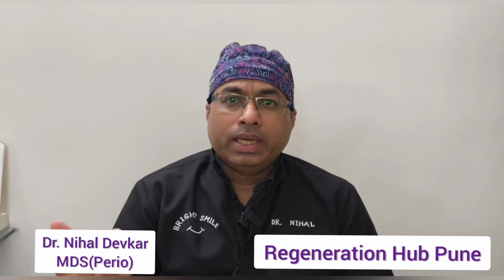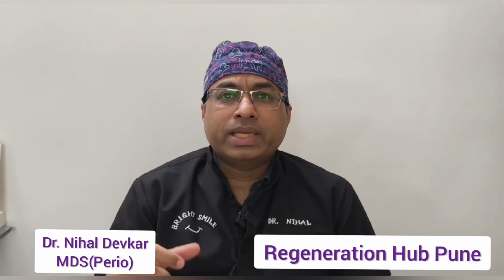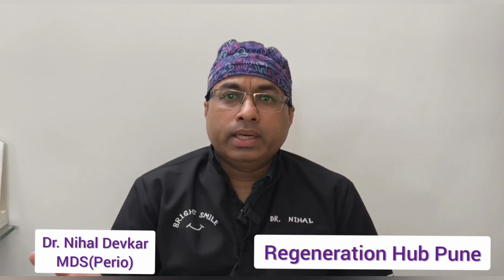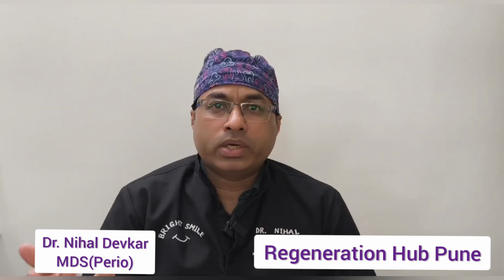So let's see the case wherein we have a situation of maxillary lateral incisors, both lateral incisors damaged, and the case has been referred to us by a restorative dentist after performing root canal as well as post and core, for crown lengthening procedure.